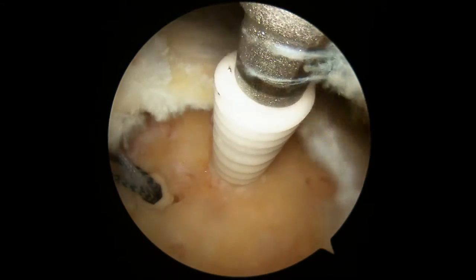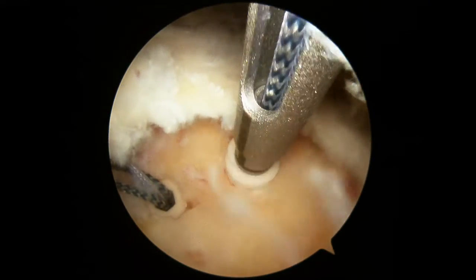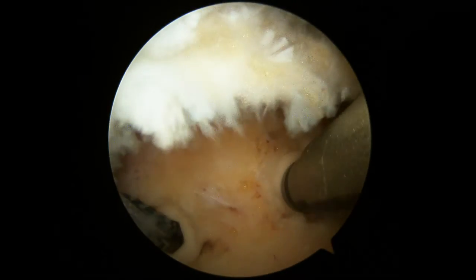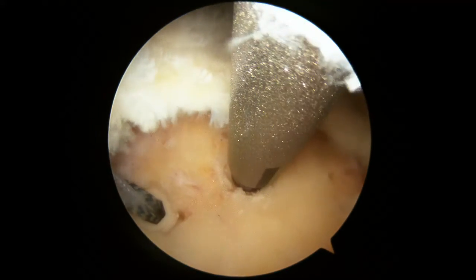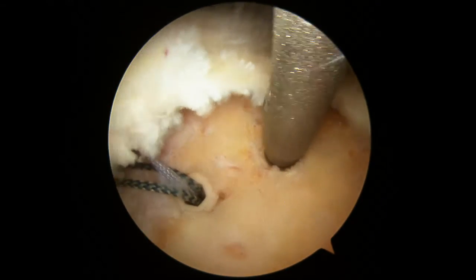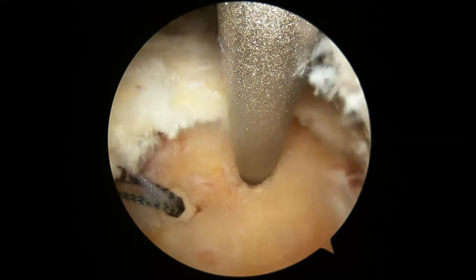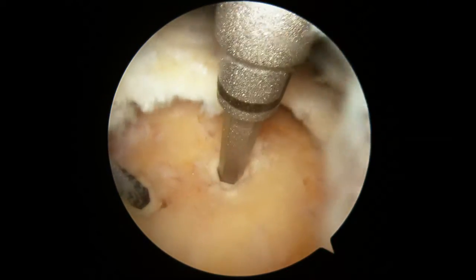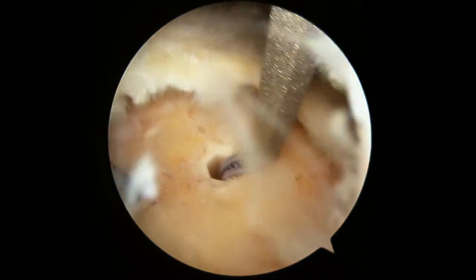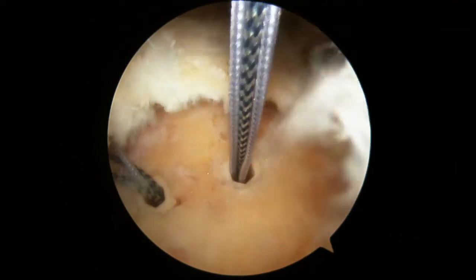The next step is to put these suture anchors in. You can see they look like a screw and I'm twisting them in, putting them in just like a screw, and you can see the suture is attached to it. I've already put one in on the left and passed those sutures. We check to make sure we're buried the right amount into the bone. The anchor screw is buried in and it's made out of a type of biocomposite material — it's not metal. We remove the inserter using a little mallet, and then you can see the suture attached inside that anchor, flushed to the bone.